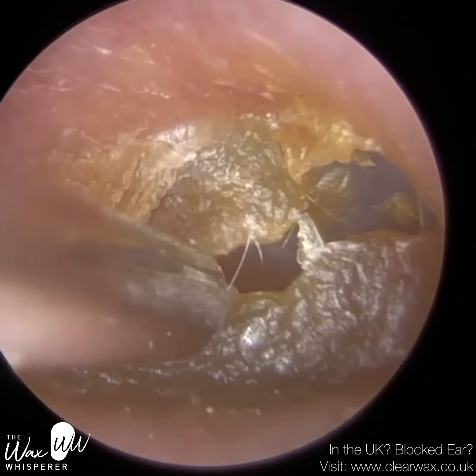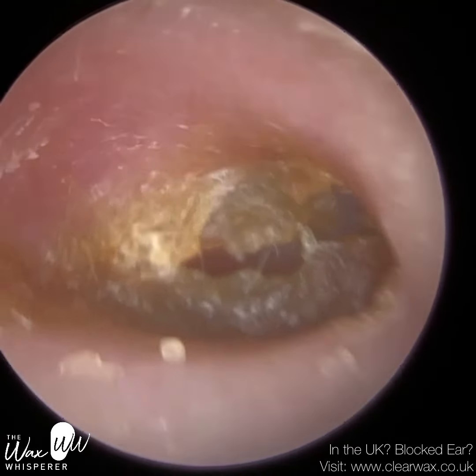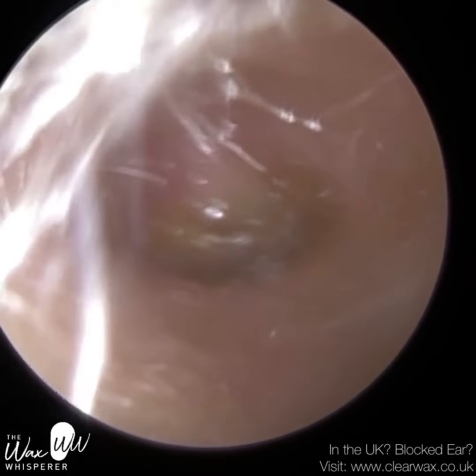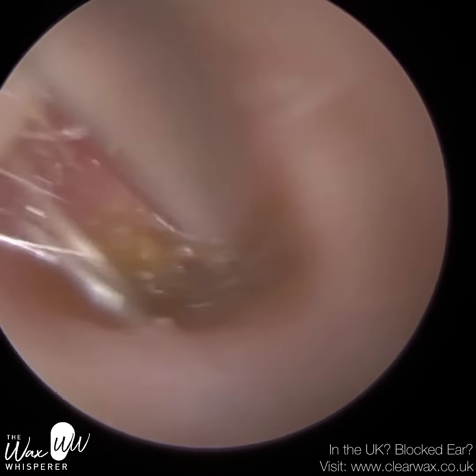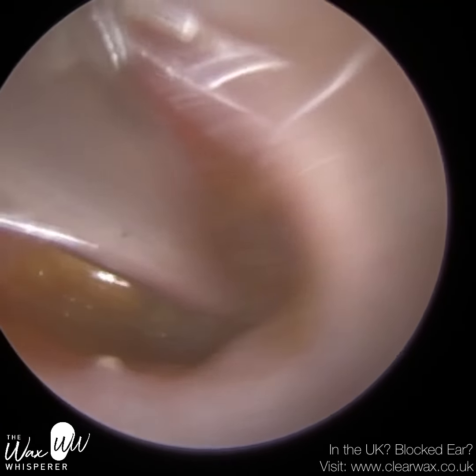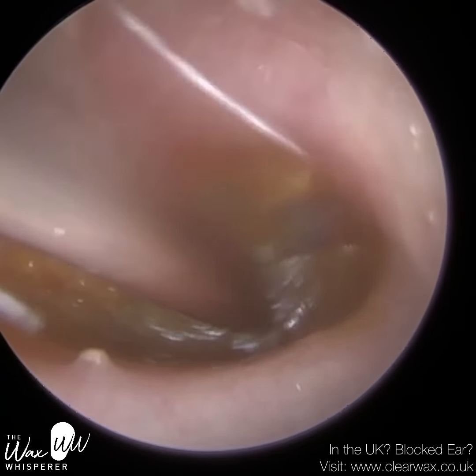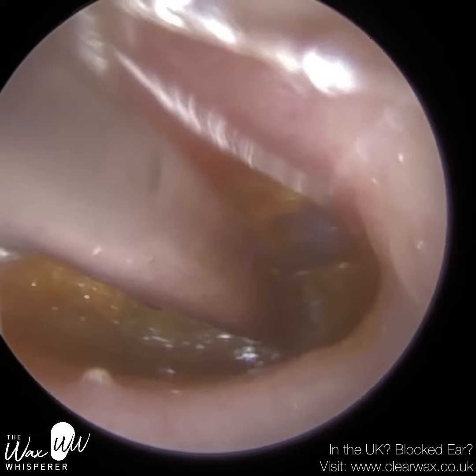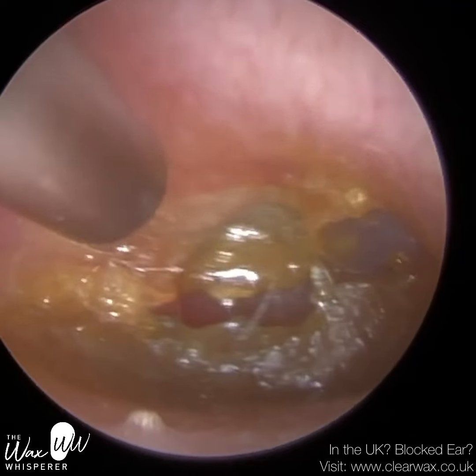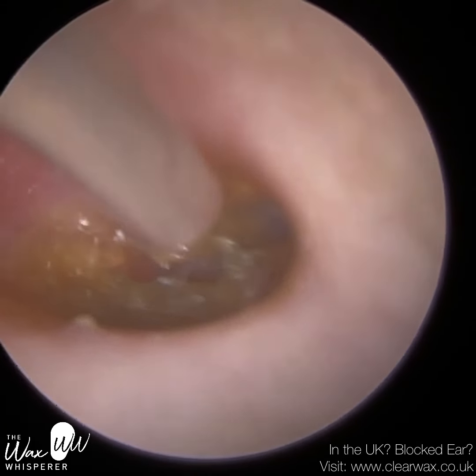But as soon as I made contact with it — I'm using a fine suction probe here because we're really, really deep in the ear — as soon as I made contact with it, I could feel how hard and crusted it was. So I immediately put some olive oil spray into the ear, which just helps to soften this dead skin. At the moment I'm just suctioning the excess oil, touching the surface and trying to get a suction grip. When it's really hard and crusted, it's quite hard at times to get a suction grip.